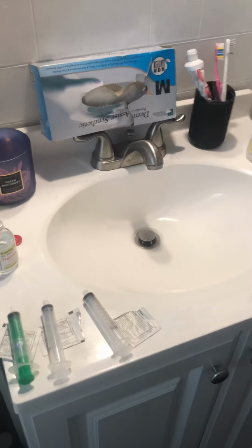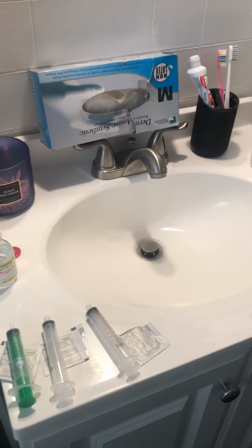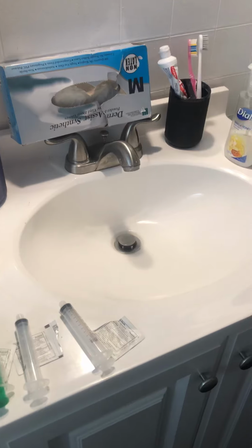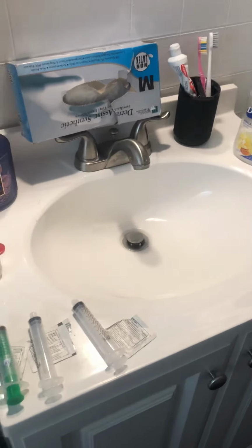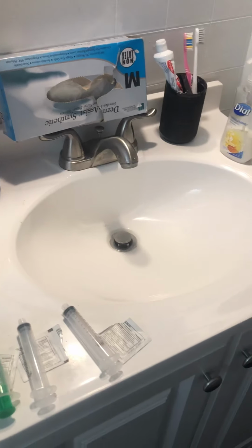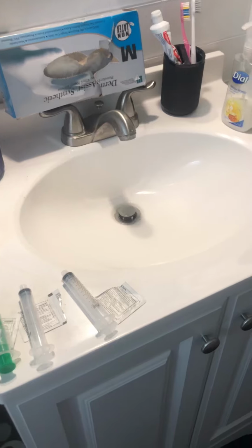So next we look at rate of administration. It says for IV injection, each 40 milligrams or a fraction should be given over 1 to 2 minutes. We are going to give it over 2 minutes because this is within the safe range.